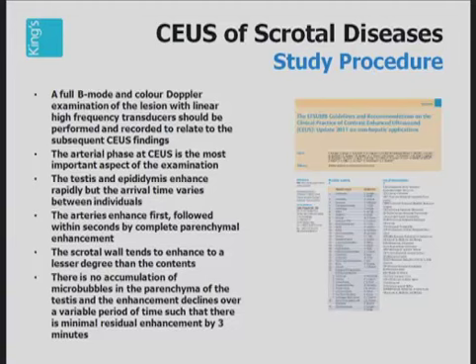The initial dose-finding studies indicated that the appropriate safe dose was 4.8 mils. However, over the last 10 years, the improvement in technology has allowed you to inject smaller and smaller doses for observing lesions in the liver. So 4.8 mils is perfectly safe and adequate for the patient.